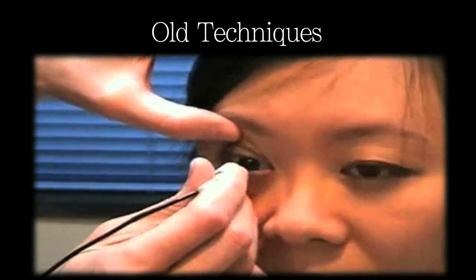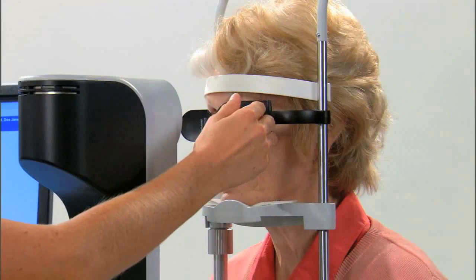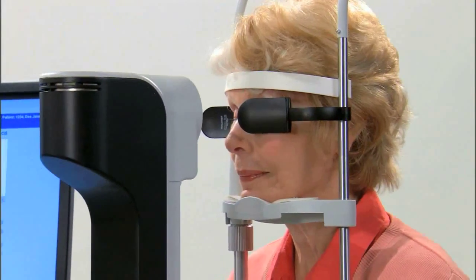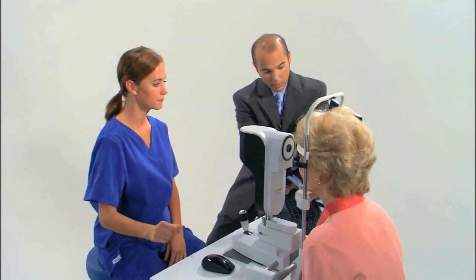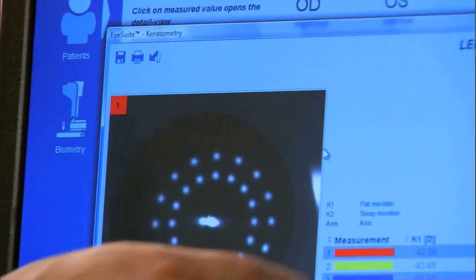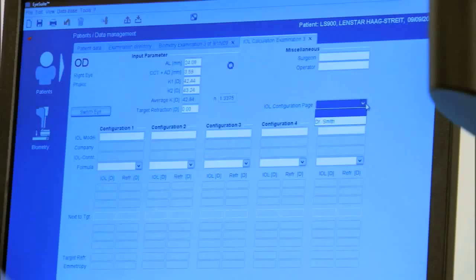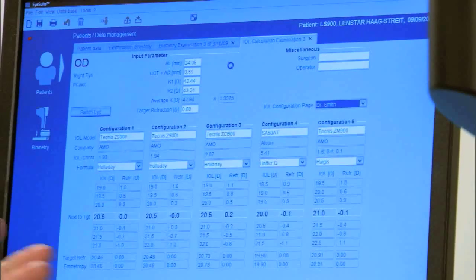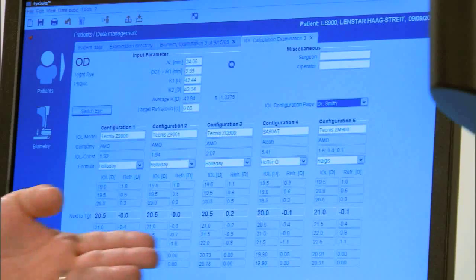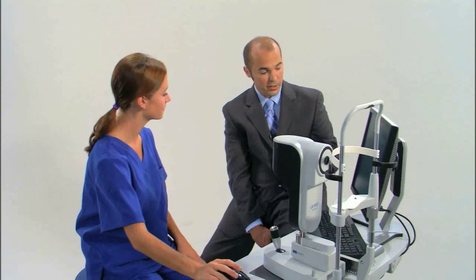In addition, ultrasound biometry is uncomfortable for the patient. With LensStar's non-contact OLCR technology, the patient never feels a thing. To obtain a more accurate outcome, LensStar offers lens thickness quickly and accurately. For the Holliday IOL Consultant, LensStar can auto-populate the patient data fields, saving you significant time and eliminating the risk and liability of transcription error.